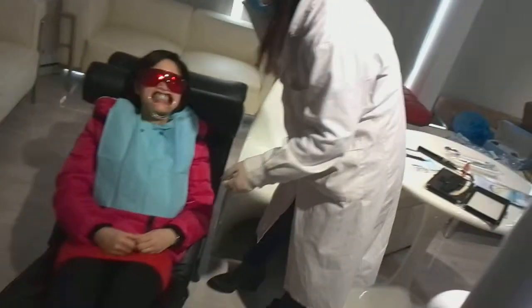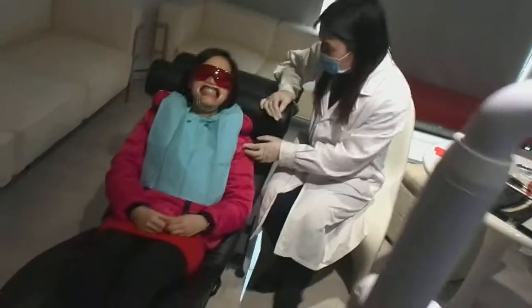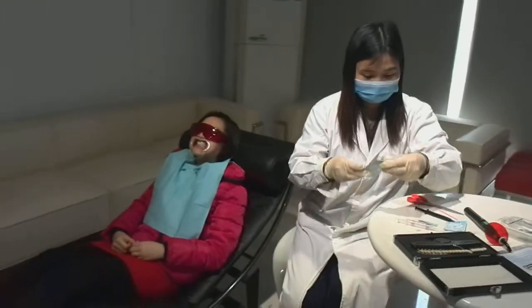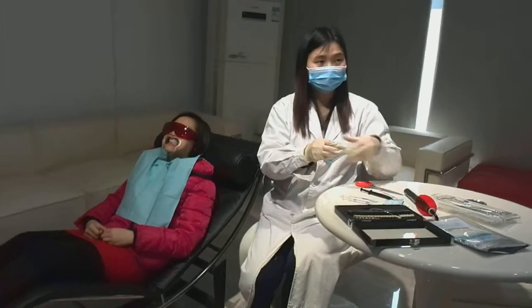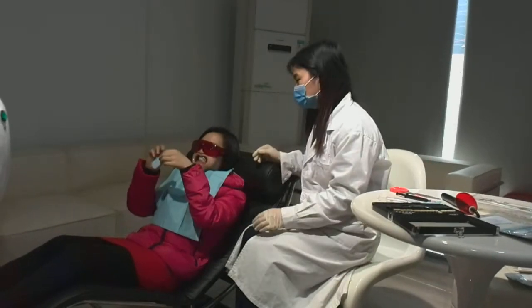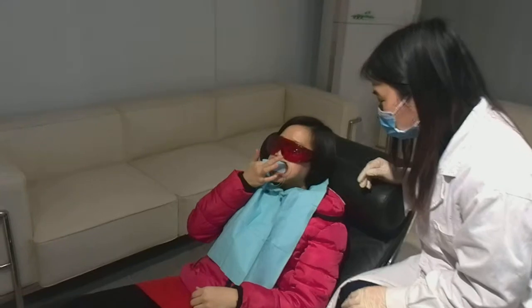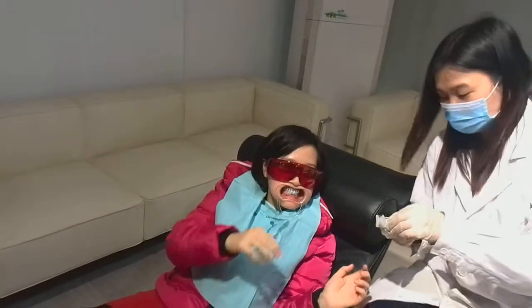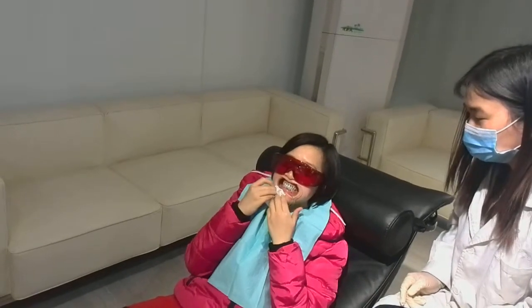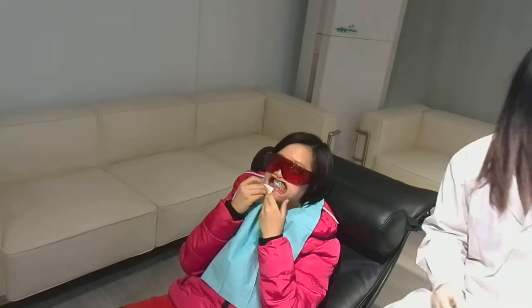First, and do the second time. It's the same steps as the first time. Compare with the shade guide.